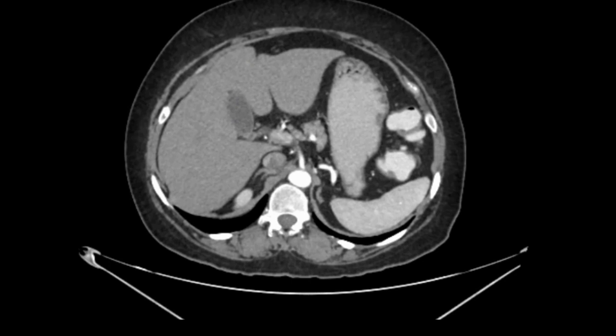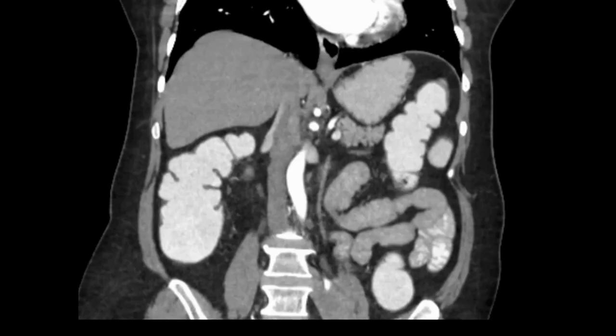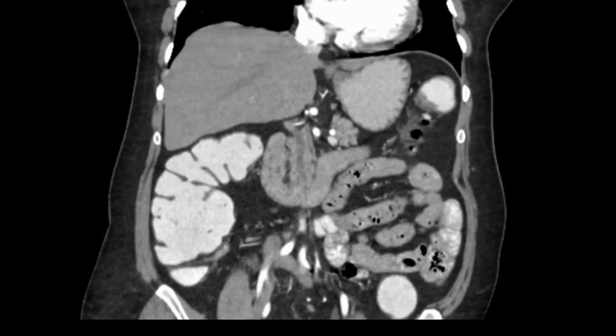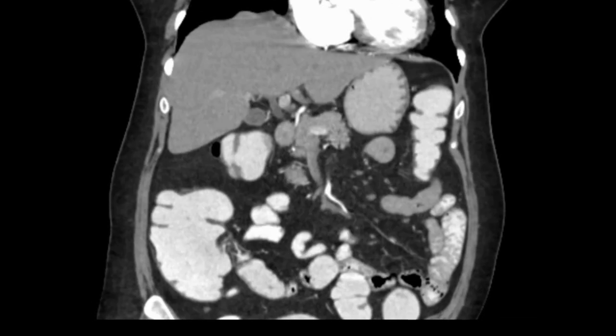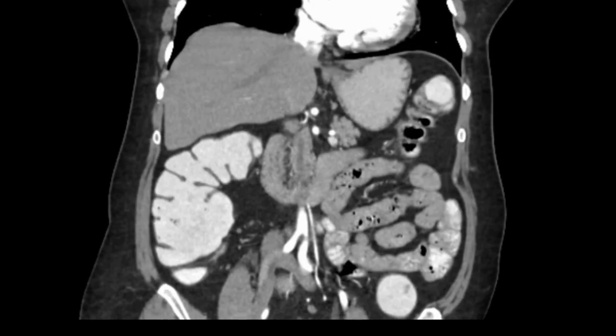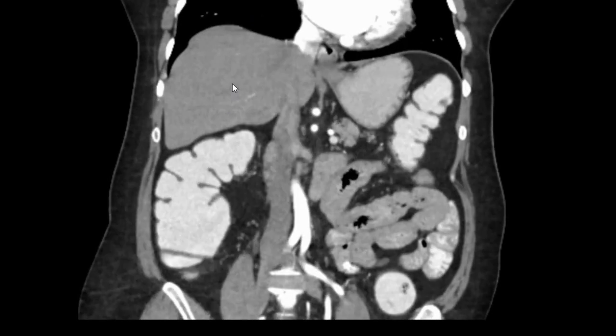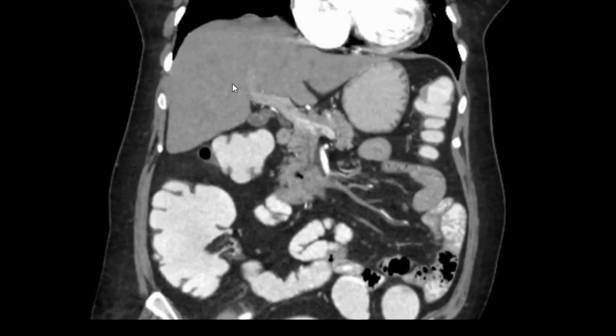Now we will see the same structures in the coronal section so that you can revise them. In this coronal section — if you see the person standing it is a coronal section — from above downwards we will revise the same structures. This is the liver.